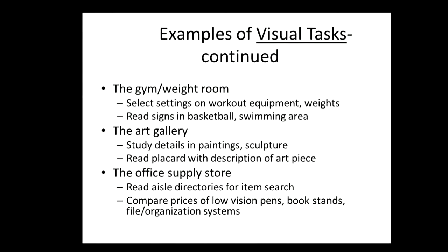An art gallery, looking at any kind of art. This is available in any community, murals on buildings, sculpture in parks. Lots of office lobbies have paintings or large framed pieces to see. And because art is meant for close inspection, this can be one of those very allowable times to use devices. If the student is able to get close enough to examine with a magnifier or inspecting it with the telescope.